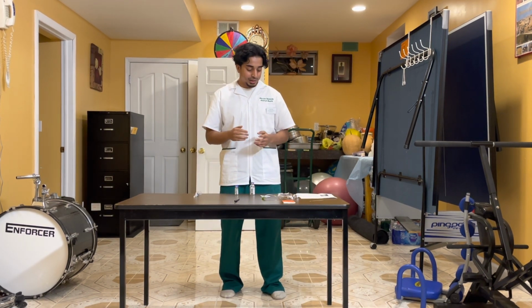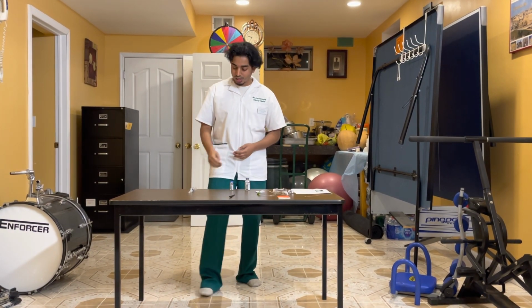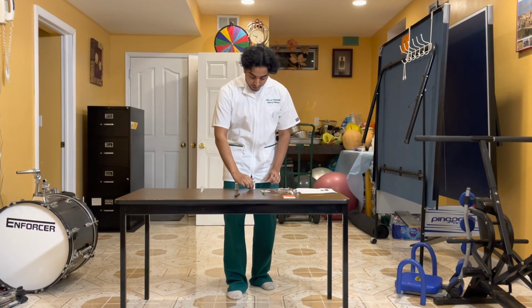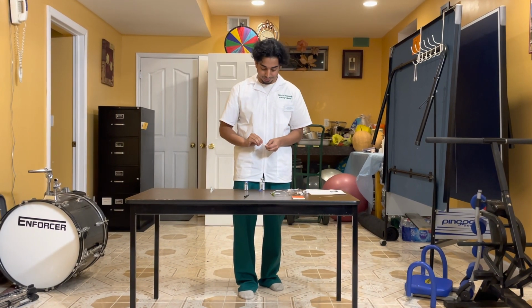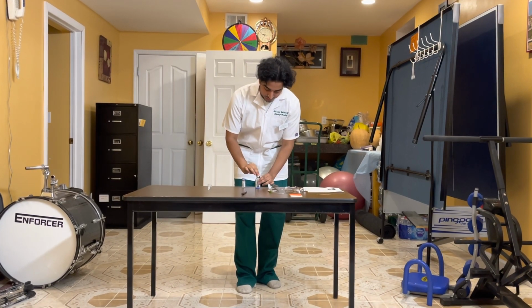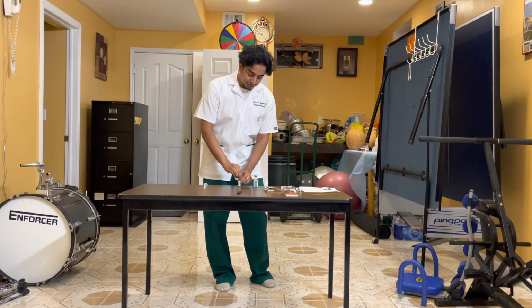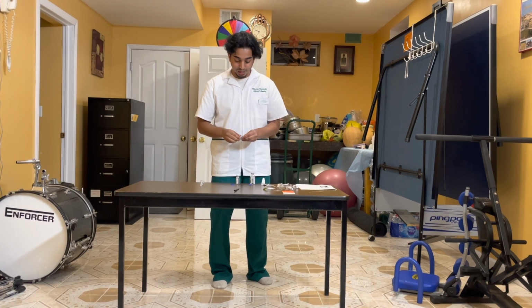Okay, great. So now that I have the medications and the calculations, I can take out my syringe. The first thing I'm going to be doing is uncapping my normal saline, and I'm going to wipe it down with an alcohol pad. I'll be wiping it down for 10 to 15 seconds. Okay, and I'm going to leave it there, and now I'm going to uncap my vancomycin, and pull out my alcohol pad and wipe that down as well for 10 to 15 seconds.